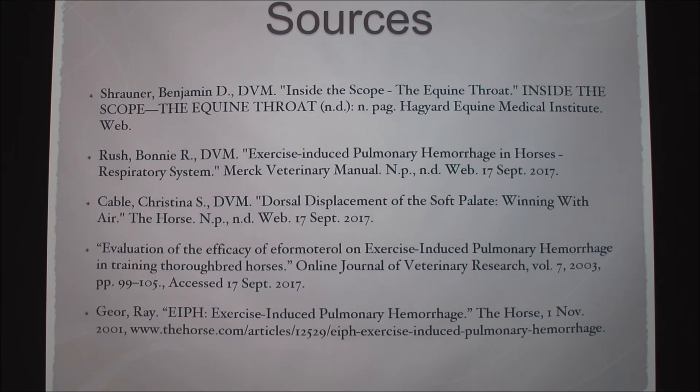I was the veterinary assistant at Indiana's Racine Racetrack for an entire summer and we did this basically every single day.